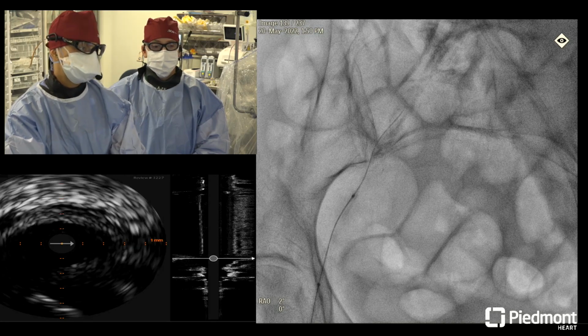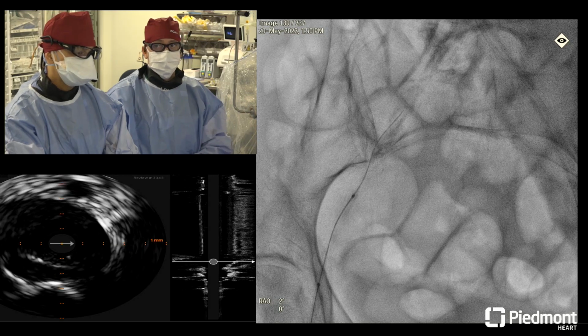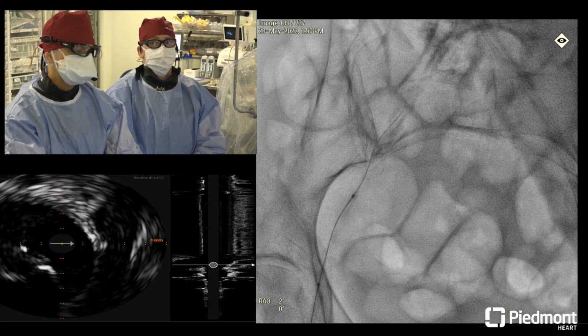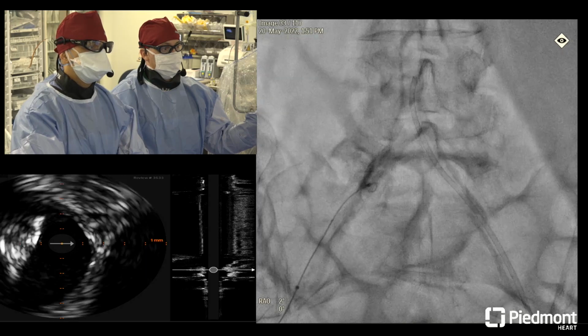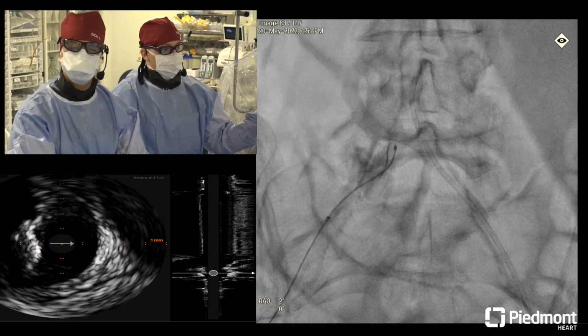I mean, you can try from up and above. That wasn't going to work, probably. By the way, the aorta looked pretty diseased on the infrarenal aorta on the first DSA, but that last shot you showed us looked a little bit more normal caliber. I don't know if that was something you were going to address or if you were going to leave it. We'll show you that too in a second, but let me ask the group also.